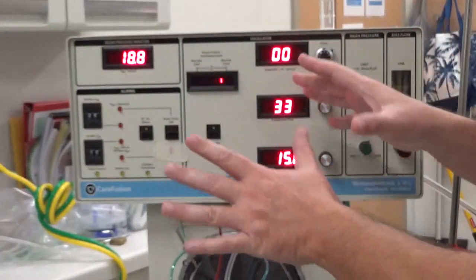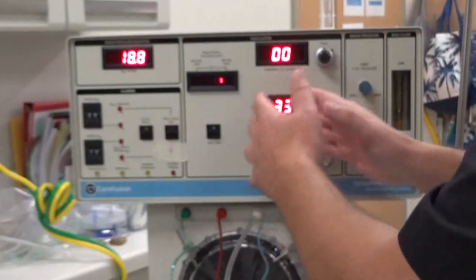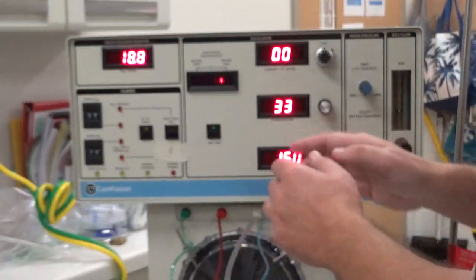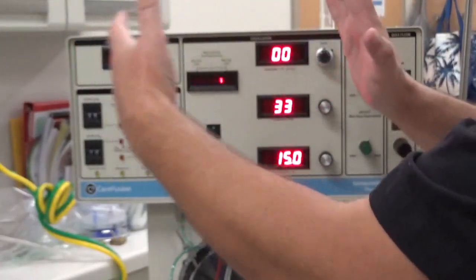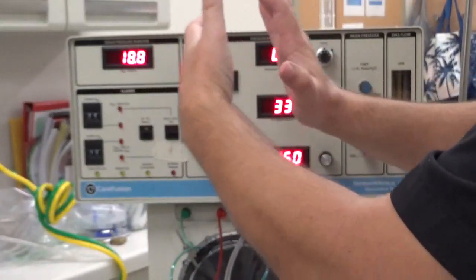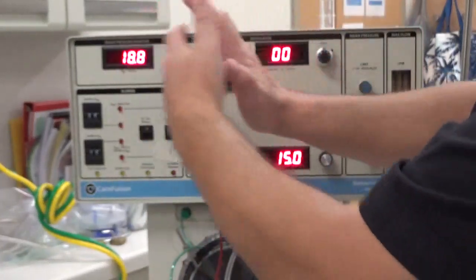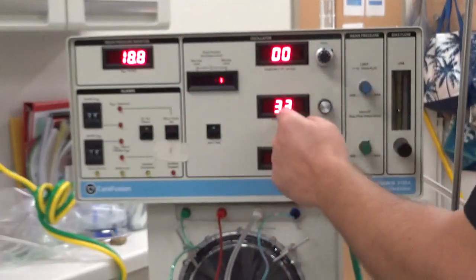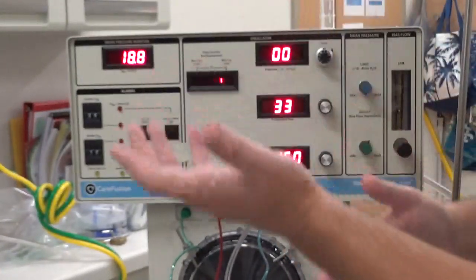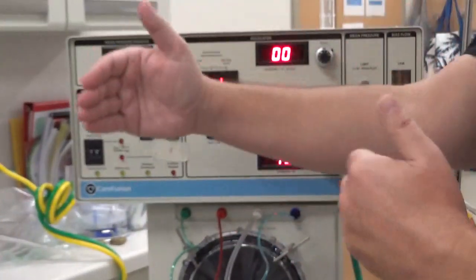Now, we can't control the flow in this ventilator. I know we have a bias flow, but that's not the same thing. So if we go down on our rate, we don't have as many breaths in a minute. We've just stretched out our I time and our E time. If we stretch out our I time at 0.33, whatever that is, now we've given more flow because we've given the same flow for a longer amount of time.